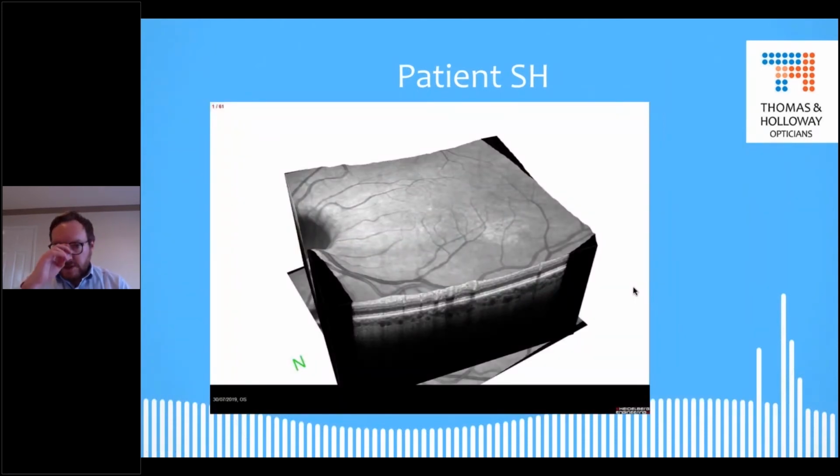Again, going back to the basics of just looking at an infrared image, if you've got a nice healthy retinal nerve fiber layer on an infrared image, the black and white scan on the Spectralis, we'd expect to see a sheen and a shimmer across the surface of the retina. So this very light grey appearance. What we can see here is a defect, a change in the reflectivity.